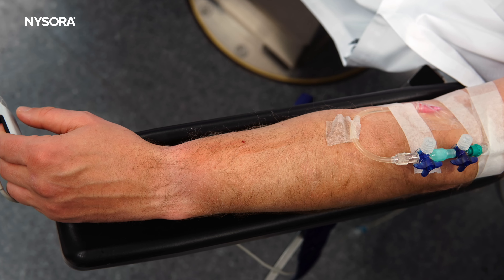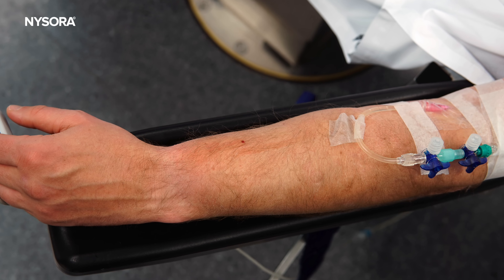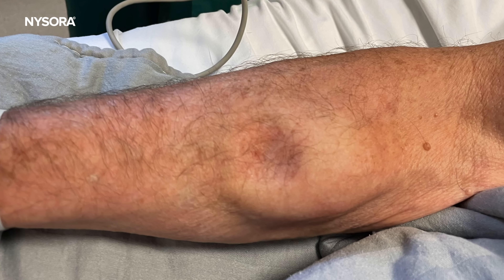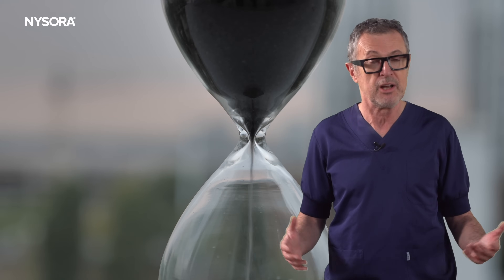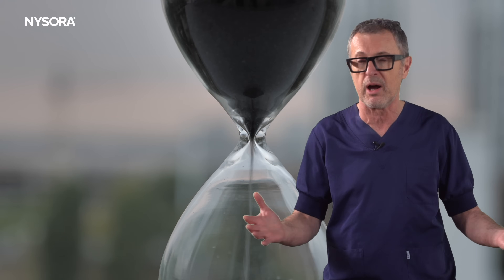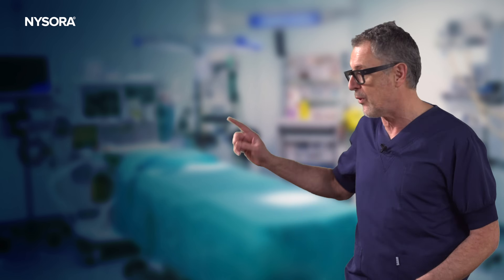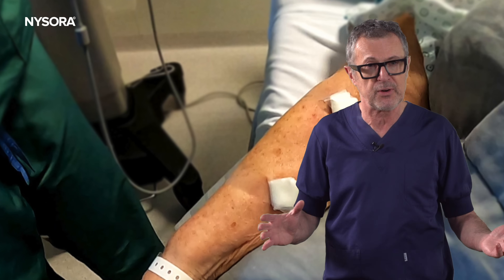You then diagnose the cause of the lack of response — reaching underneath the surgical drapes, you find that the IV line has been infiltrated. Your vasopressors are not working because they are being injected subcutaneously where the IV catheter now sits. You now have a hypotensive patient without an IV, and recall that placing the IV in the forearm was already difficult due to the patient's obesity.